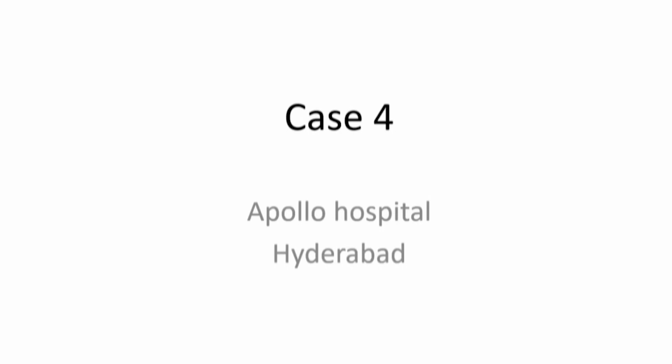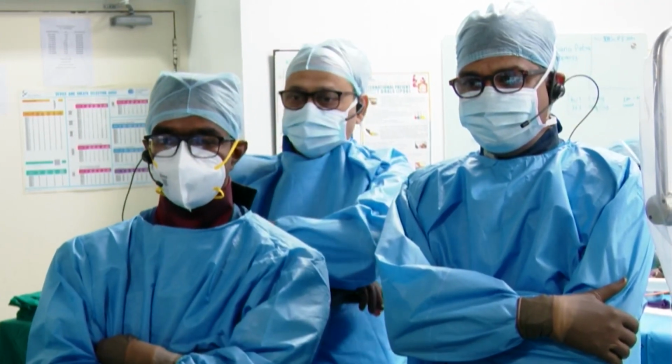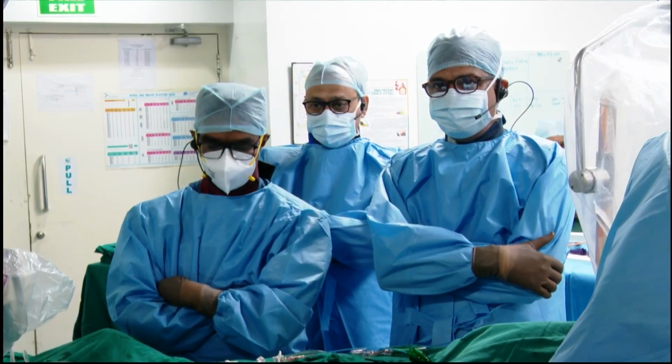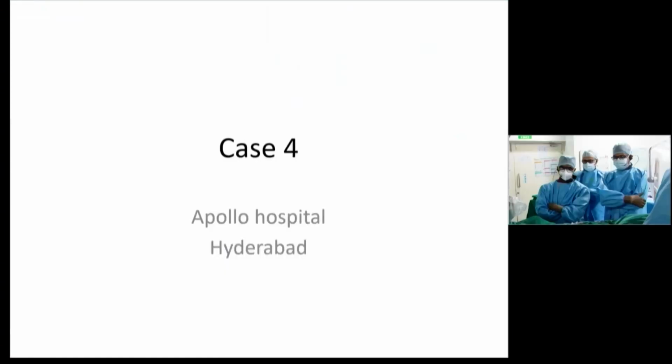So we've just finished the case in box by Dr. Sai Satish of a complex mitral clip, and the audience is also here, a fair number of people. We are waiting to see your very, very complex case. I believe the low coronary heights. So we are looking forward to see what innovation you use.